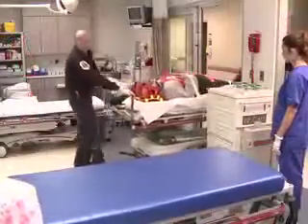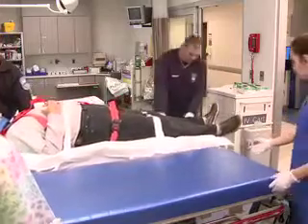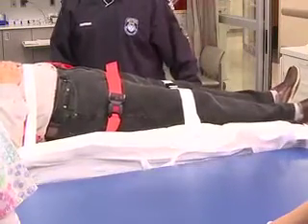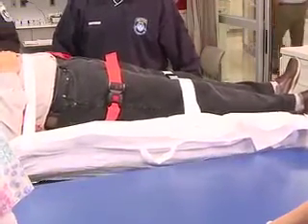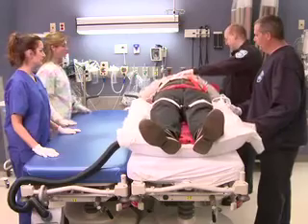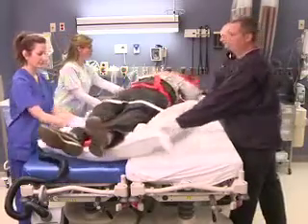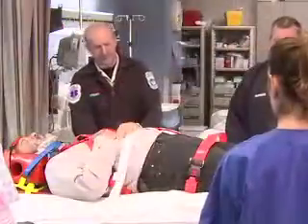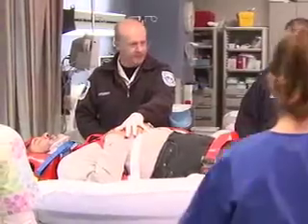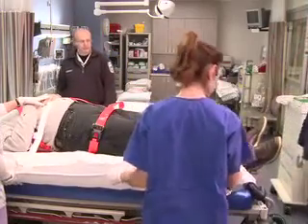In this segment, there are no linens on the stretcher pad for demonstration purposes only. Linens should always be applied on top of the HoverMatt for patient use. Lower the receiving surface or raise the sending surface 1 to 3 inches for an easier lateral transfer. Use the HoverTech Stay Close approach to transfer the patient's inflated HoverMatt transfer mattress at an angle, feet first, onto the receiving surface. Remember to always inform your patient and assume the position of safety before inflating and deflating the HoverMatt. Ensure the patient's body is centered on the receiving surface prior to deflating the HoverMatt.